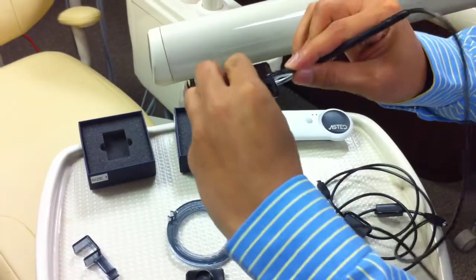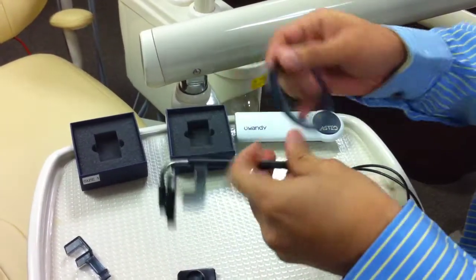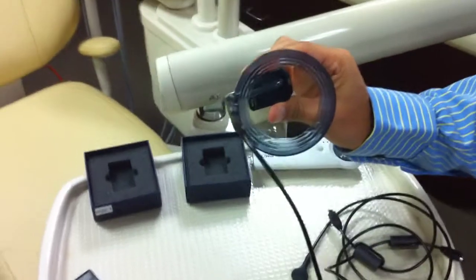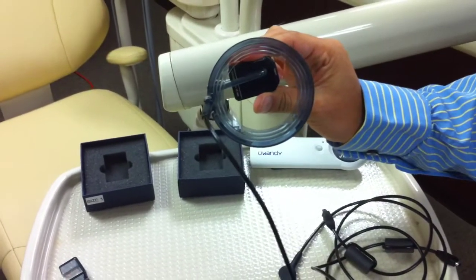Now, if I wanted to get a better angulation, I can use the ring. I just snap the ring right on the cable, and now I get a perfect shot every single time with the ring in here.